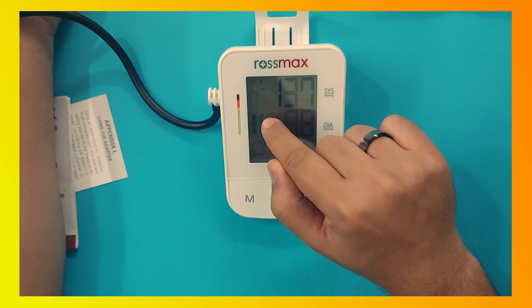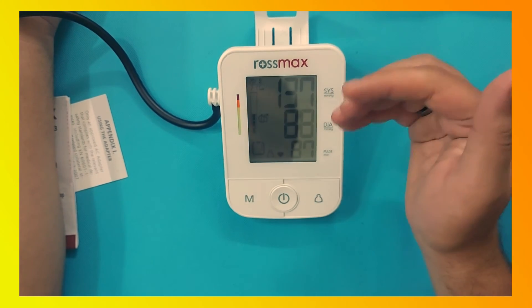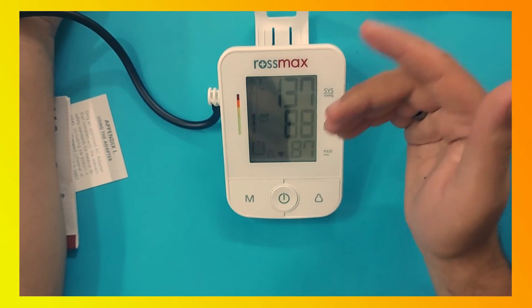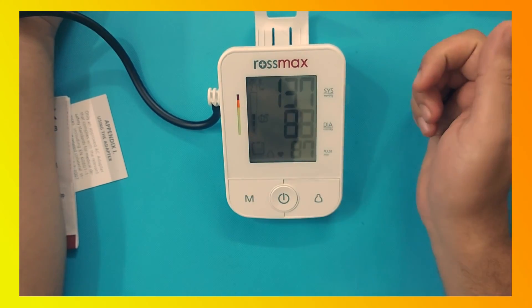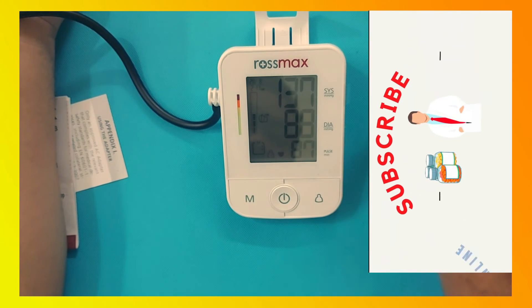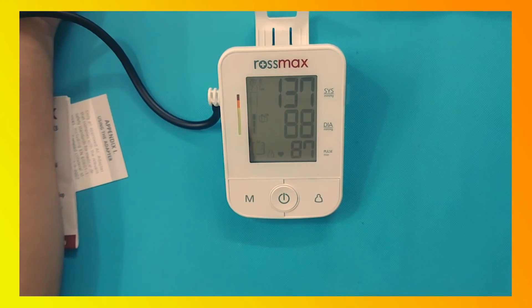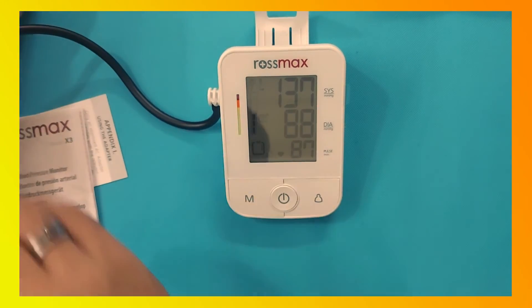These values have color indicators. If the BP is normal, it will show in the green level. If it's elevated, it will show in yellow, and if it's high blood pressure it will show in red. The Rosemax X3 monitor also has motion detection, as shown in the instructions on the box.